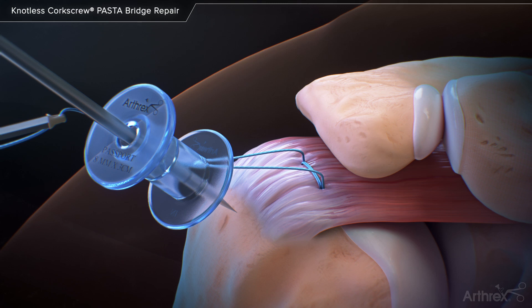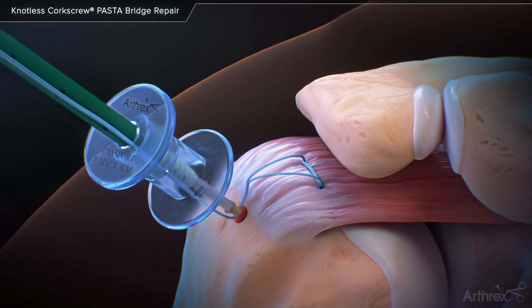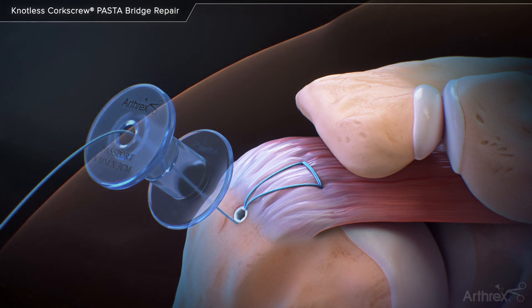The suture limbs are then retrieved out of the lateral portal and inserted into a 4.75 biocomposite swivel lock anchor laterally to complete the bridging construct for additional footprint compression.